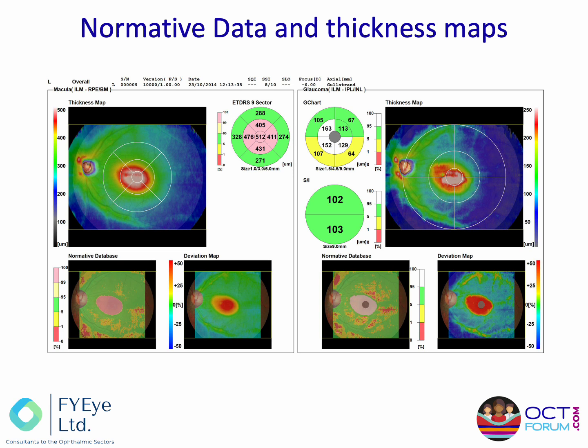We can see that the multiple B-scans have been taken across a 9mm vertical and a 12mm horizontal area over the posterior pole in this example. In total, 128 horizontal B-scans have been captured and placed together to build up a wider understanding of the layer thicknesses and total retinal thickness across this area. It is then possible to also compare these measurements to normative data. In a later video, we'll look at these in more detail and explore some of the issues with normative data.